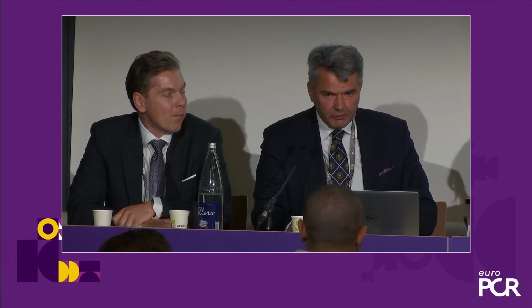Yes, so over the last years we were talking about zero contrast, low contrast, ultra-low contrast, so it's confusing. So let's say the best rule is to give the same amount of milliliters of contrast as the GFR. This will be safe. Many people say that less than 20 is the definition. Zero contrast is still possible, so there are some cases when you use really zero milliliters of contrast. But in general, in high-risk patients, of course, lower is better, and we say low contrast PCI for many patients.